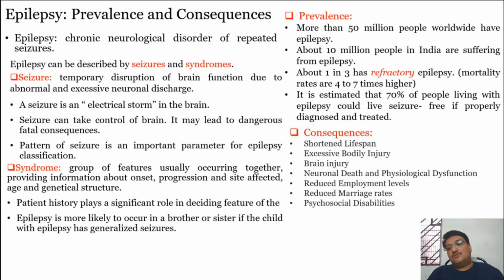One more thing I would like to clarify here, very important, is that when a person is experiencing a seizure, it's very difficult to record EEG, because for EEG recording you are placing electrodes on the head of the subject, right?